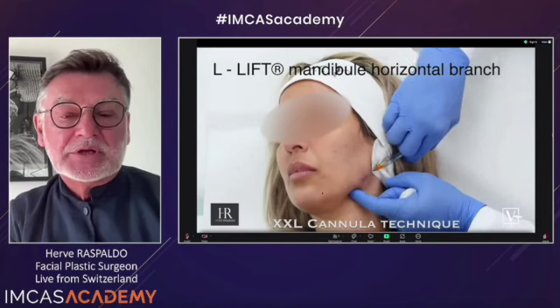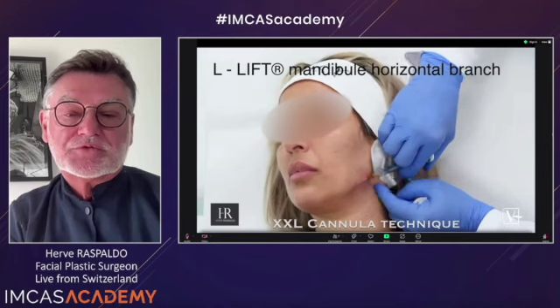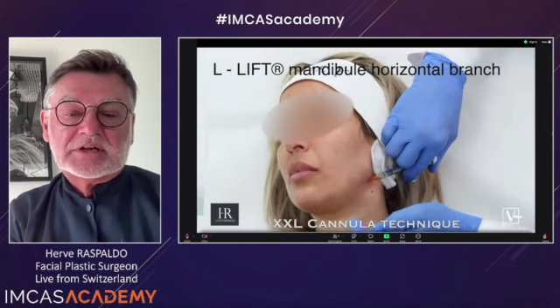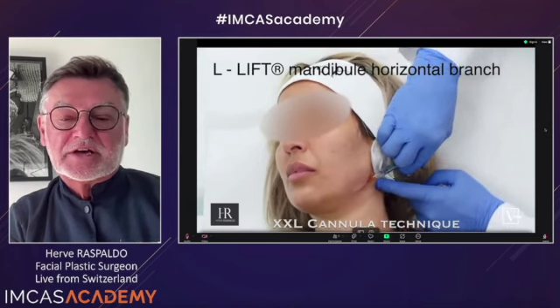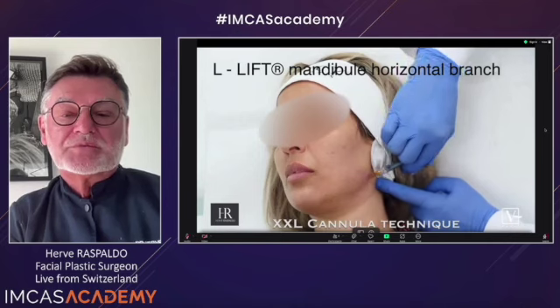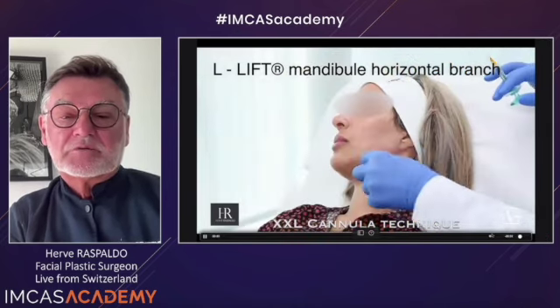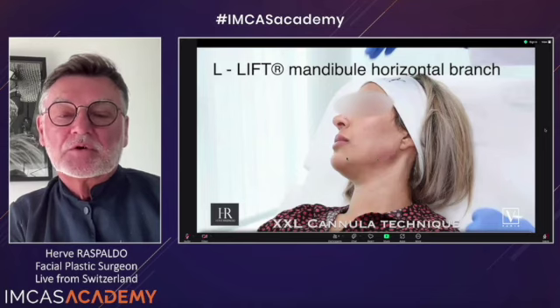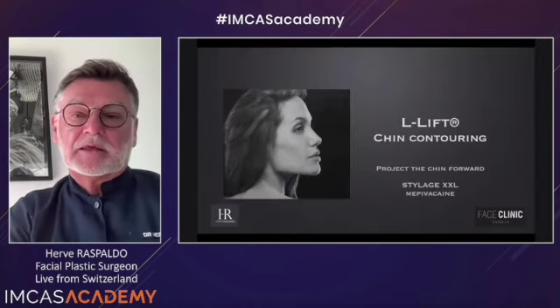And I like to be on this fat pad and the superficial fat under the skin, and then you break the retaining ligaments thanks to this cannula. And the cannula is great not only to inject, but also to do the subcision with this up and down movement to break the retaining ligaments. And you see, you can add a little bit more if you want, but then you have this horizontal branch of the mandible well defined.